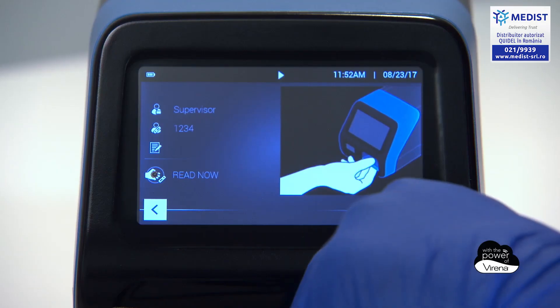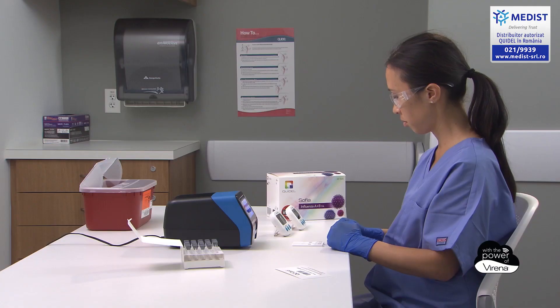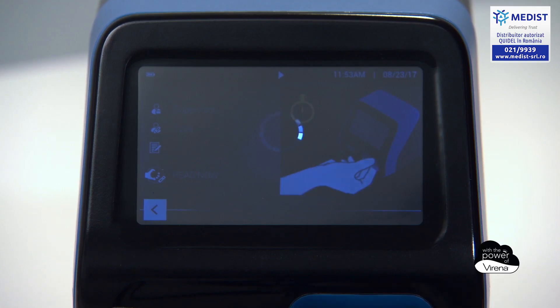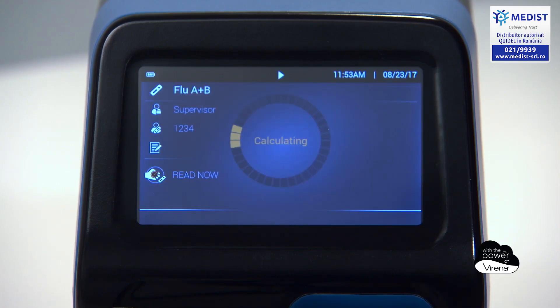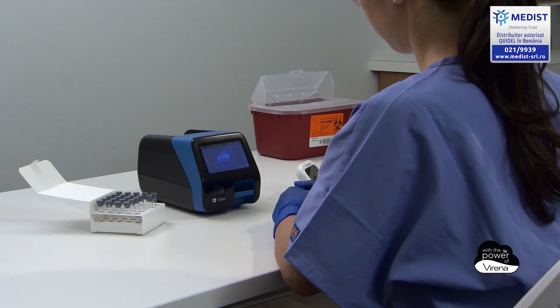When in read now mode, users allow the assays to incubate on their laboratory bench. At the end of the 15-minute period, users follow the on-screen animation and produce a result in about one minute.